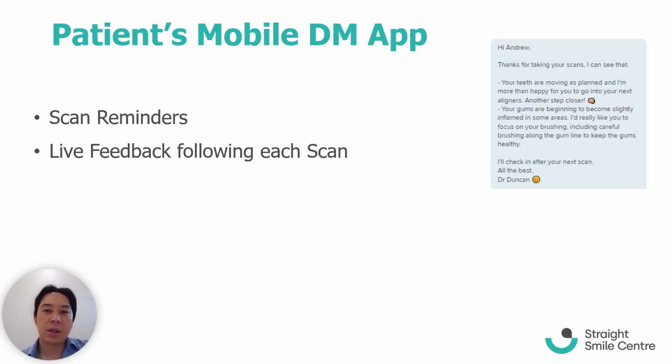As you can see, it basically allows the patient to progress and change aligners straight away. They know they're doing really well, and they will be sent another scan reminder at the following week or 2 weeks, whichever you set your scan intervals to be.